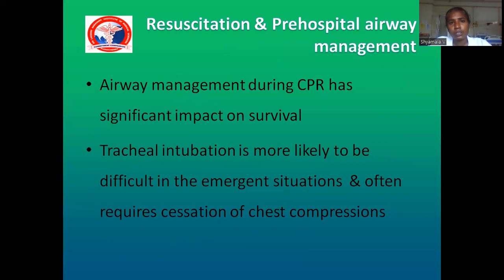Then it can be used in resuscitation and pre-hospital airway management. Airway management during CPR has a significant impact on survival. Because during CPR, airway is very important; you have to intubate, then maintain the airway. Otherwise, the patient will desaturate. Once desaturation occurs, vital organ perfusion and oxygenation will not be adequate.